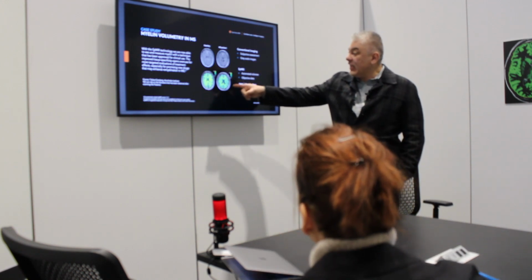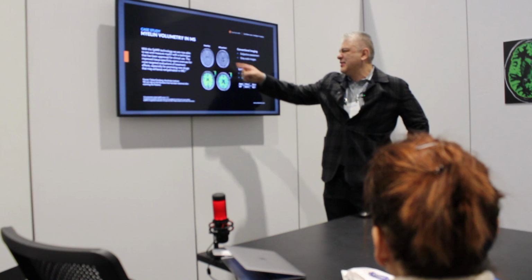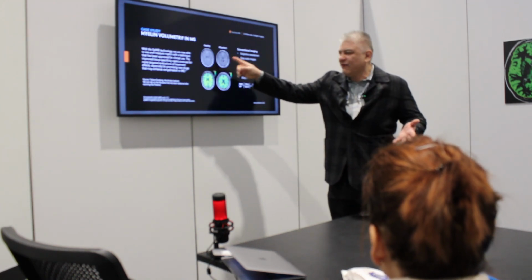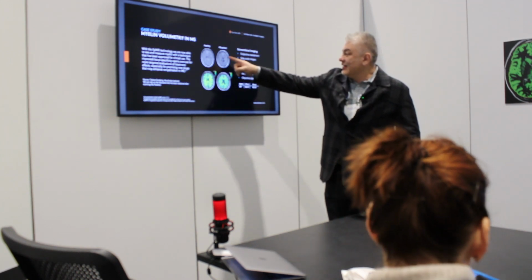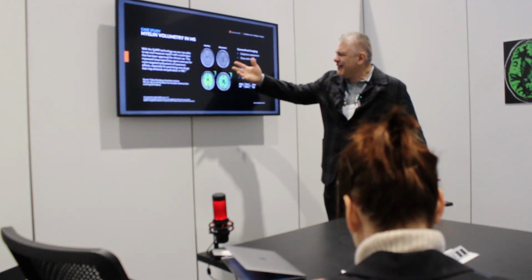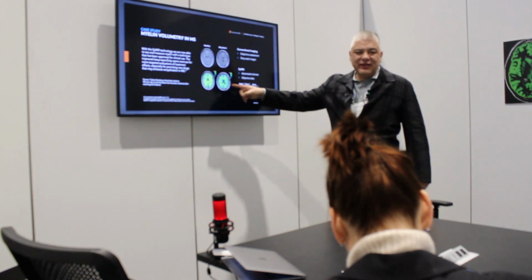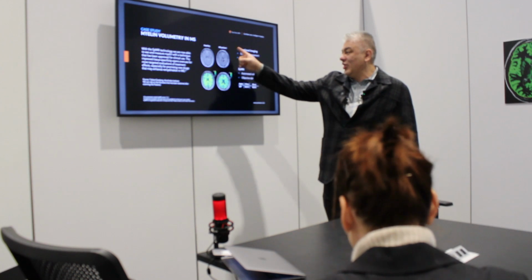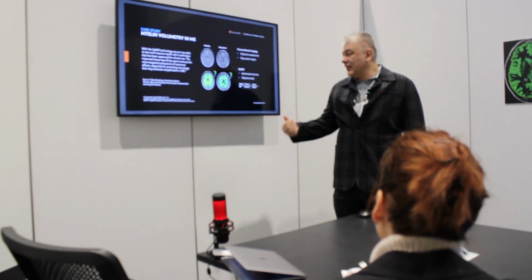You can see that in this case, these lesions are not very specific. You might even say there are a few, maybe little infarcts, not the classic Dawson's fingers or anything. But you can see that even in areas where you see a lesion there, but around here, maybe not, you can see in the map that it's clearly diminished globally. It's very obvious that it's not just the lesions, but everything else in the brain. So, next, and we're going to show more.